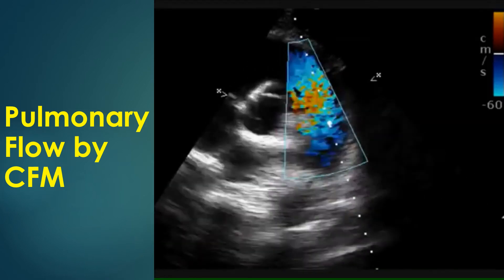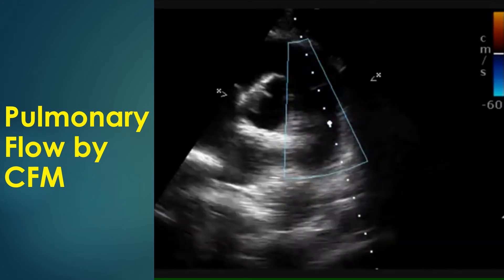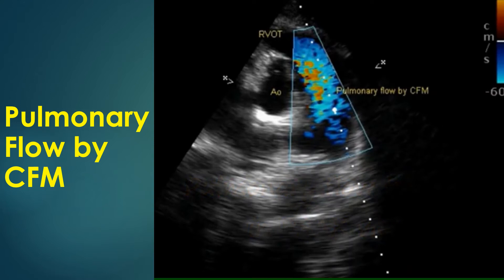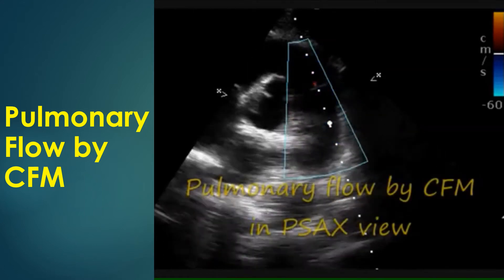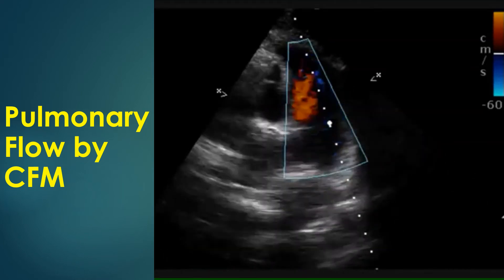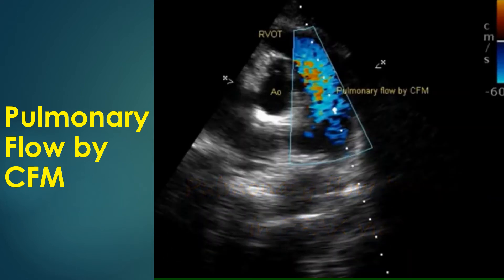Parasternal short axis view showing right ventricular outflow tract, pulmonary artery, and aorta. The right ventricular outflow tract and pulmonary artery are seen curving around the aorta to form the circle and sausage appearance. Pulmonary artery is identified by its bifurcation into left and right pulmonary arteries. Color Doppler shows a blue flow directed away from the transducer. A tiny reverse flow of pulmonary regurgitation, appearing like a small flame-like jet directed upwards from the pulmonary valve in the closed position, can be seen in most individuals.